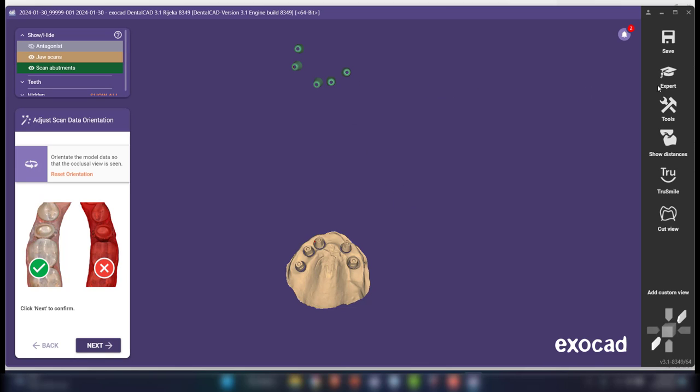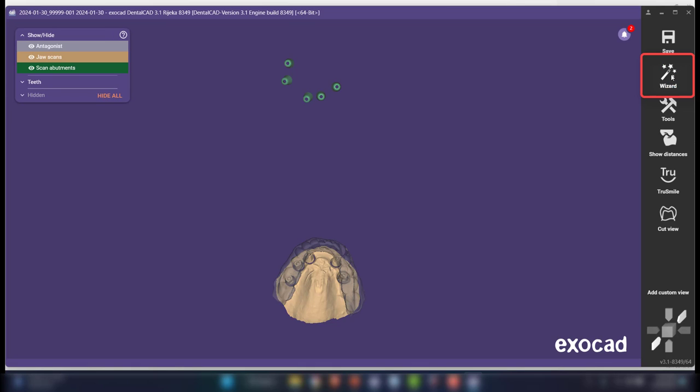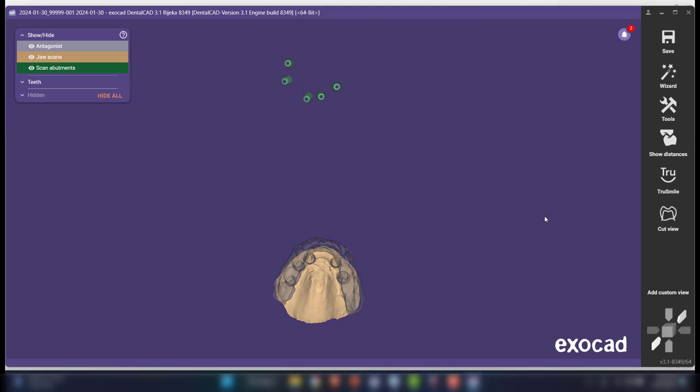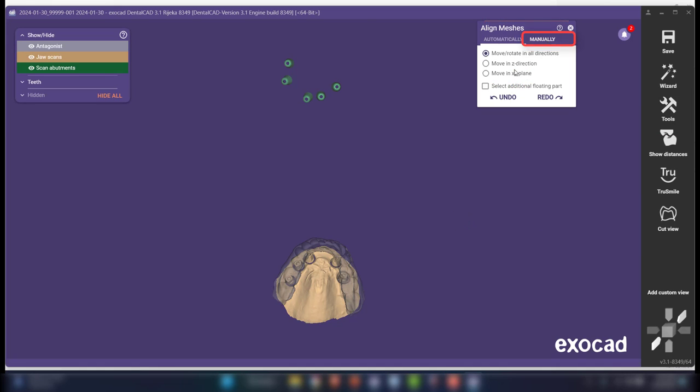And since they are unrelated to one another, the first thing I'm going to need to do is just stitch those two together. So before I do anything else, I just go ahead and go to expert mode. And under expert mode, you can go to your tools and look at align meshes. All right, got a few options. I'm going to go manually first because this is a lot easier once you get them somewhat closer to one another. I'm going to hide the antagonist.